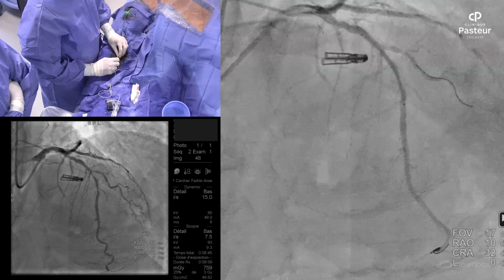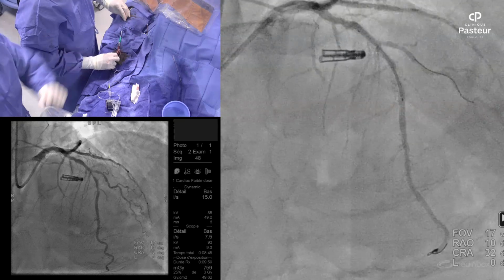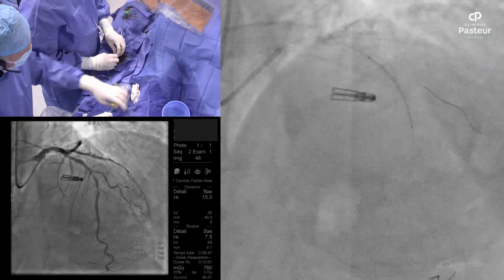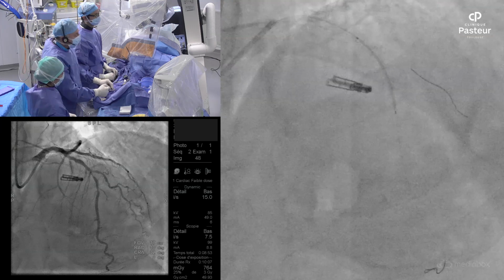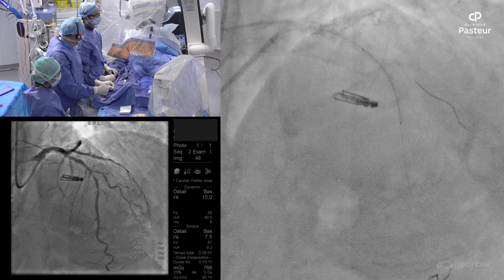I think 28 could also be possible, but we have less safety in the proximal part of the bifurcation. Okay. But between both there is 6 millimeters. It's not a major difference. You are more precise than us, Flavio. That's why you are able to use the 28.